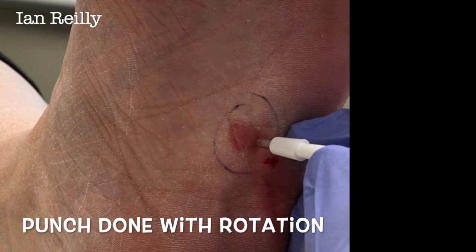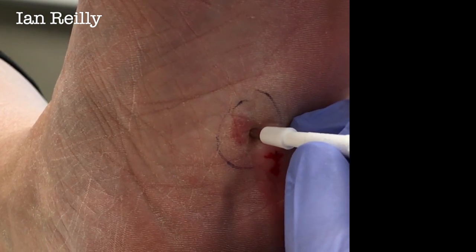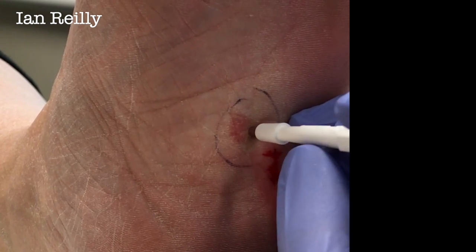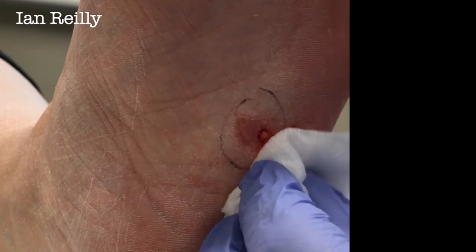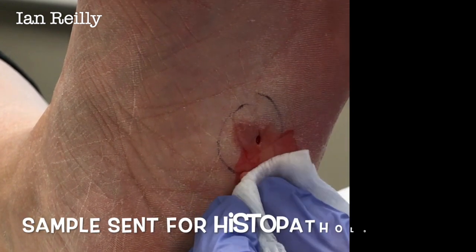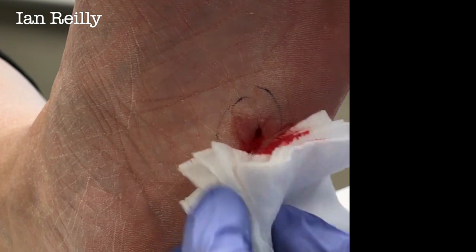We don't want to take the edge. We want to take all the lesion. And it's just a bit of a twisty motion till we're through the skin. And that's our lesion there. Sometimes they just need a little bit of persuasion, as in that case. So there's our lesion there. A little bit of claret.